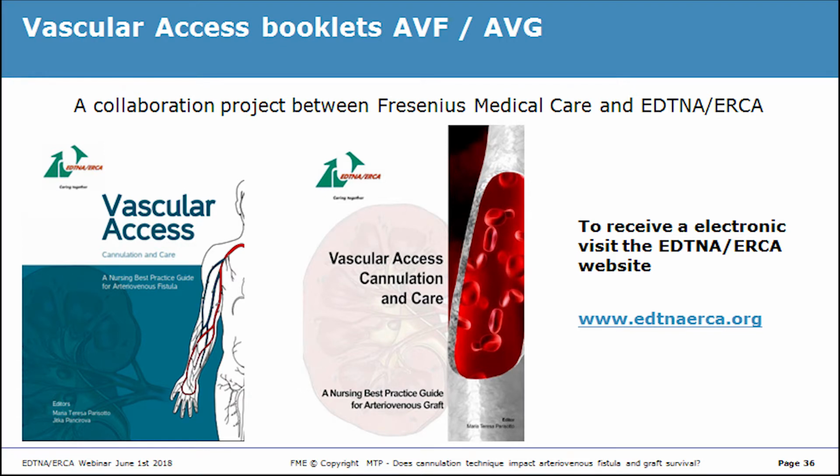We have another question. Is it recommendable, or what is your opinion, to use echo Doppler previous to the puncture of vascular access? It can be recommended, but for sure not for all cannulations. For sure, it is recommendable to use the ultrasound with a new fistula, or a complicated fistula, when you do not know them. But if you have a fistula that you know very well, without complications, without any type of problem, I don't think that it's necessary to always use ultrasound guided cannulation.